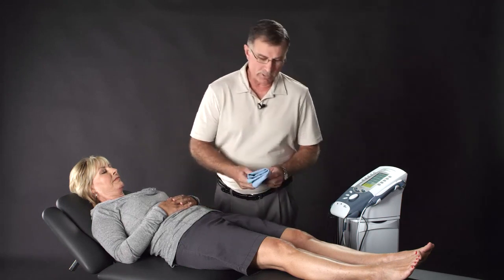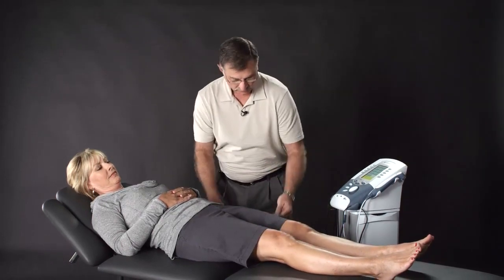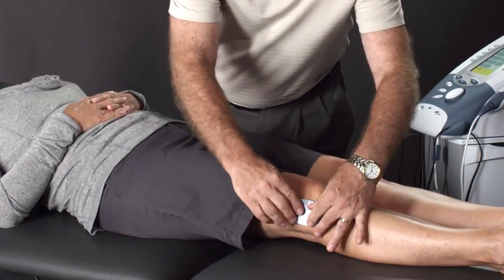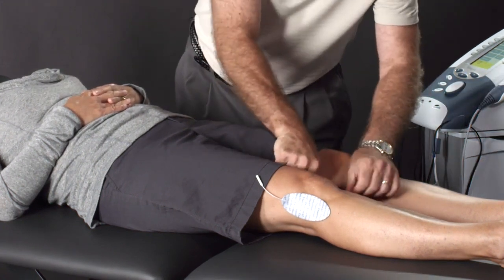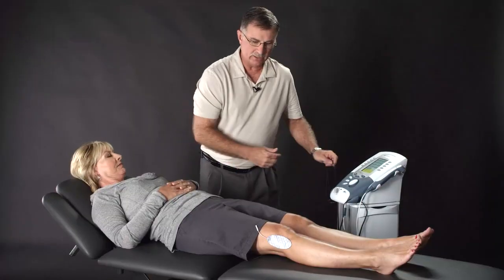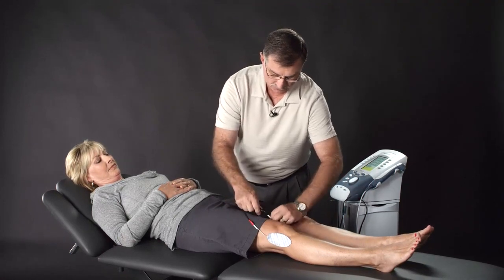At this point, we want to prep our patient's skin with our warm washcloth in the water to remove any excess oils. We then want to take our electrodes. We're going to place on either side of the knee. And now we're going to take the lead wires from channel 1 and plug those into the electrodes.